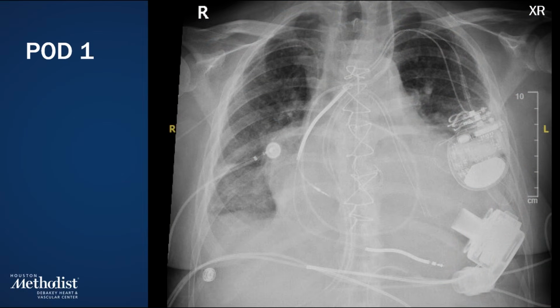On postoperative day 1, the patient had no acute overnight events. Postoperative chest X-ray demonstrates successful chest closure and appropriate LVAD position.